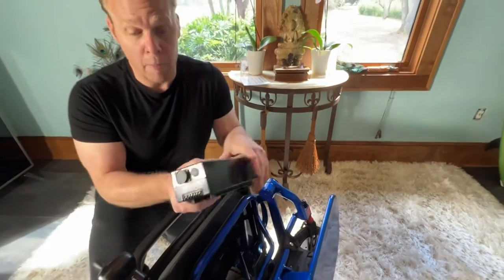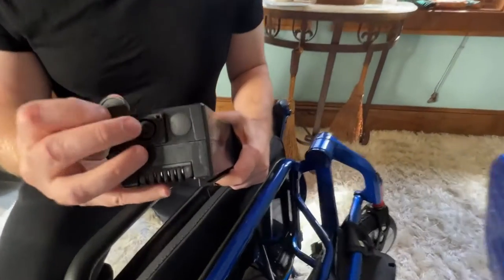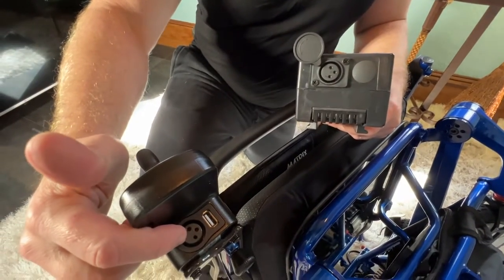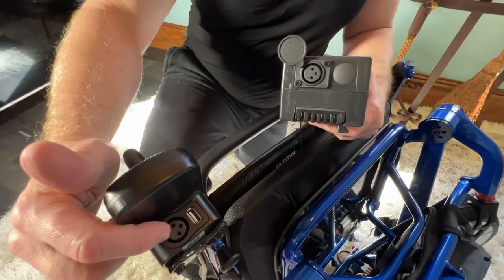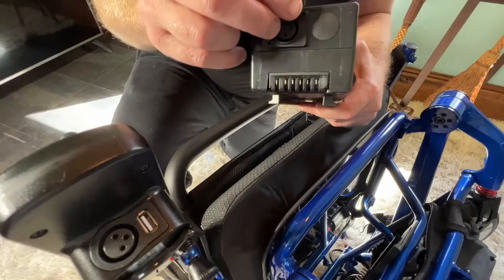Now we've made a video about charging the chair also. The charger plugs in directly to the battery, or if you have the battery plugged in and the joystick plugged in, it plugs in right to the joystick as well. And there is a convenient USB port on the joystick.